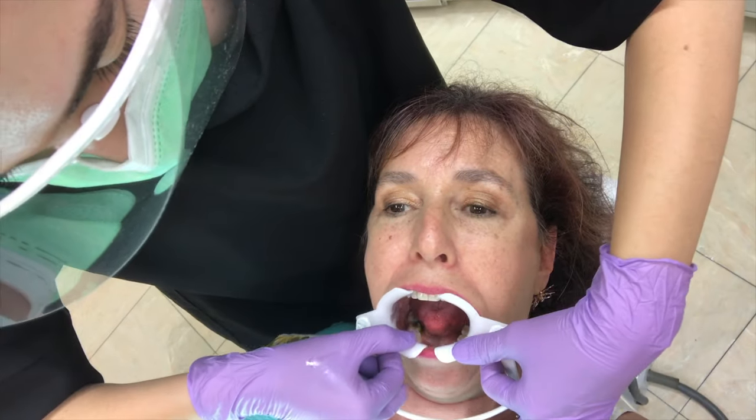Okay, so we just sanded off that little tiny bit — you don't feel it at all, don't worry, it doesn't hurt. We've taken off almost every single one of the attachments. It's not unpleasant — I wouldn't say it's pleasant either because you've got to keep your eyes shut with a little water splattering — but honestly it does not hurt. We're going to go back to the beginning now and put everything back in.